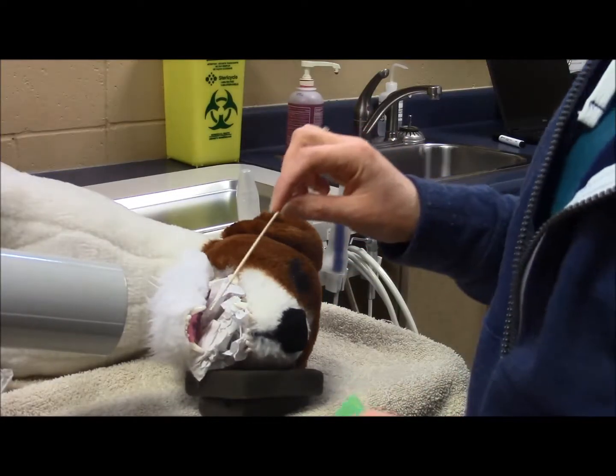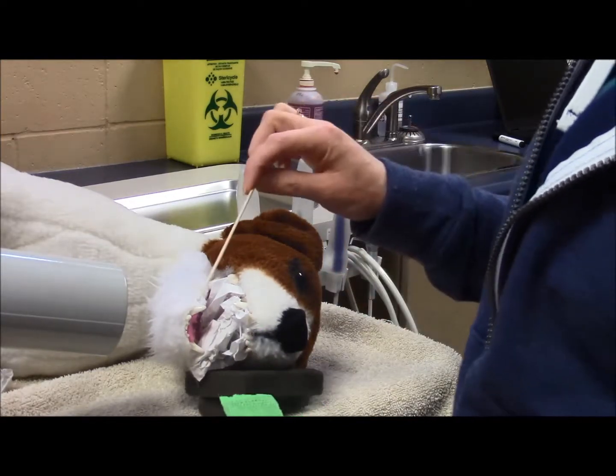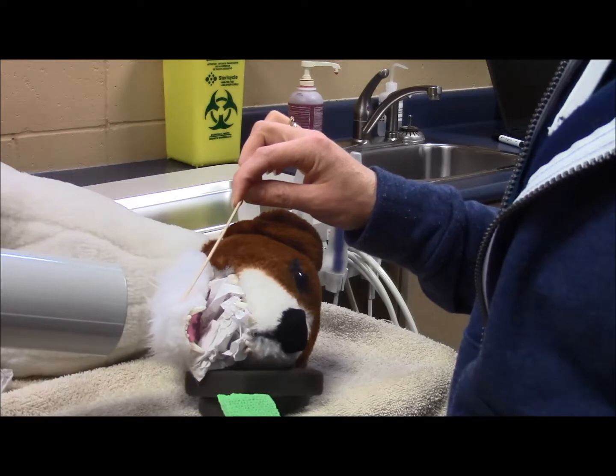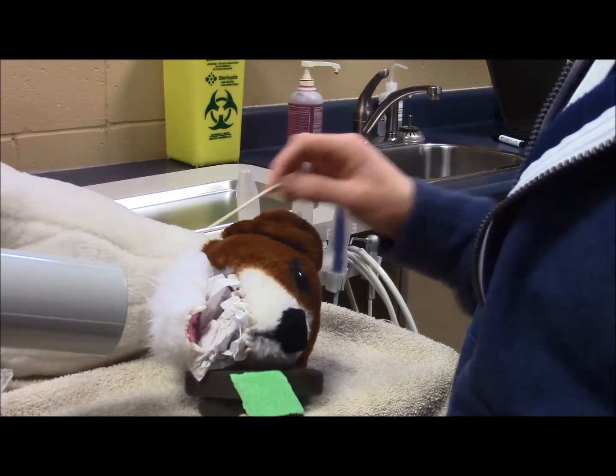To image the mandibular canine tooth in a larger dog, likely what I'm going to have to do is take 2 radiographs, one to capture the crown and some of the root, and then I'm going to reposition the sensor to capture the apex of the root.